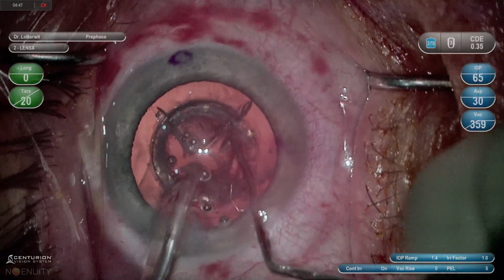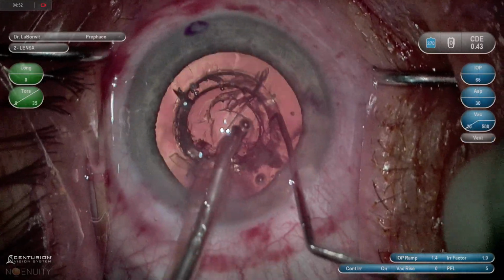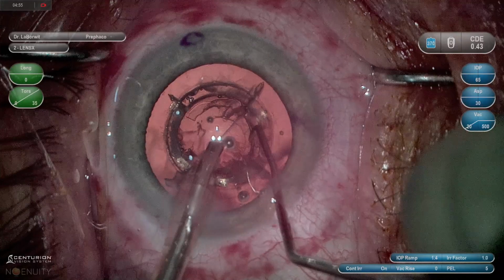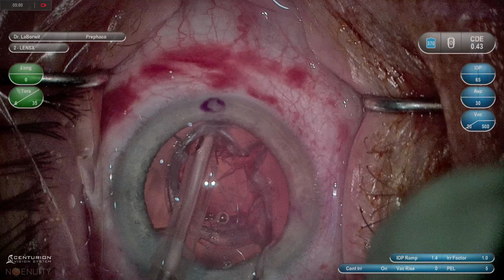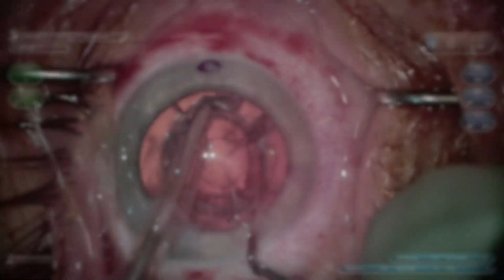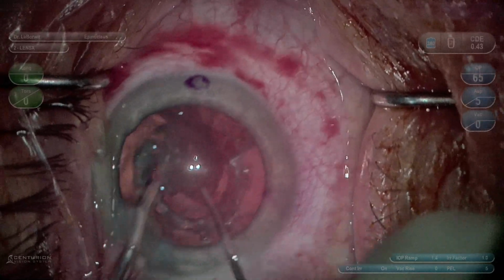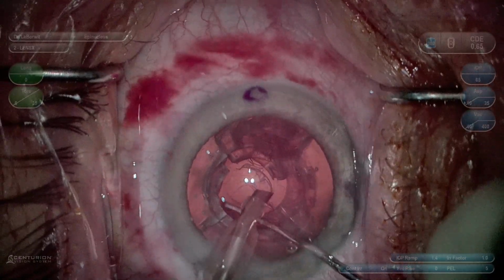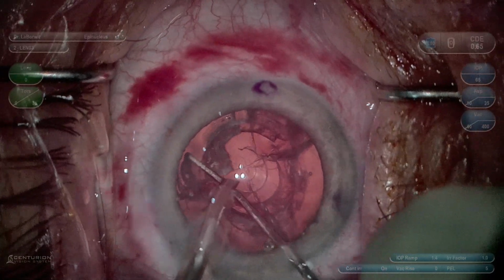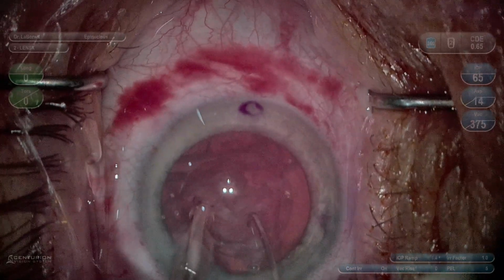Again, pay close attention that the phaco tip's not unsafe at any point during the case, because it's never angling down and it's not reaching beyond the 5mm capsulotomy. Once I remove the central plug, I'm then cracking and then bringing that second instrument in to then pull the piece to me. Having known sizes of quadrants and plug sizes makes every case very consistent, and you gain more and more confidence with your second instrument, who really becomes the star of the show.